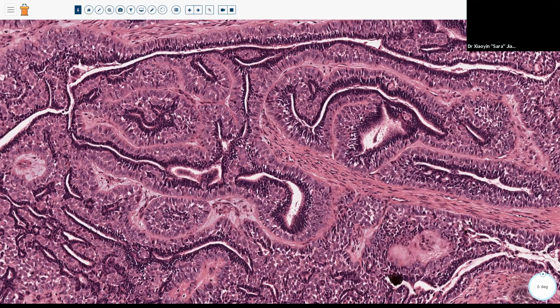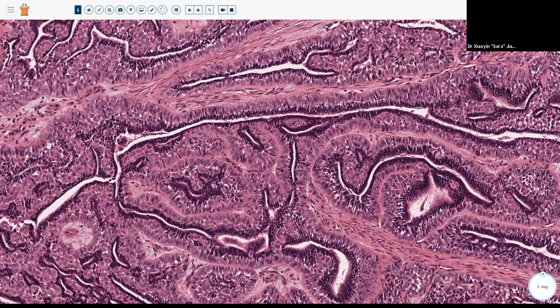So this is a rare tumor, biphasic, right? Again, epithelial and myoepithelial. Parotid is going to be the most common site for these, and typically these are low-grade tumors. And I tend to think of IHC in the salivary gland as something where you can use it to help highlight the different cell populations that are there.